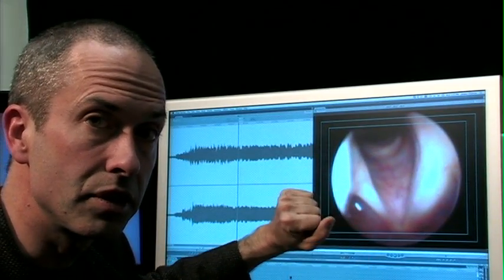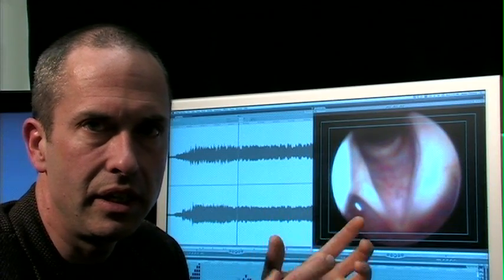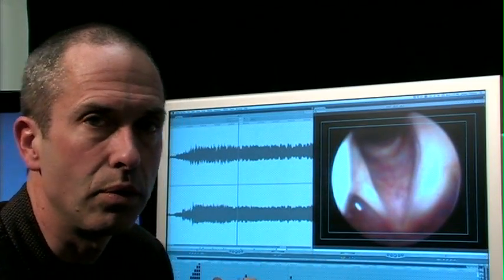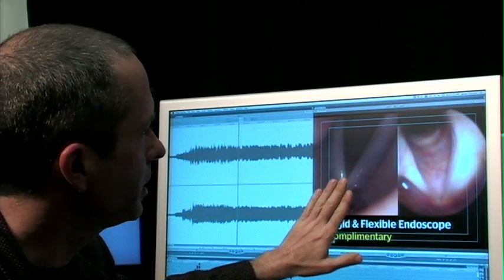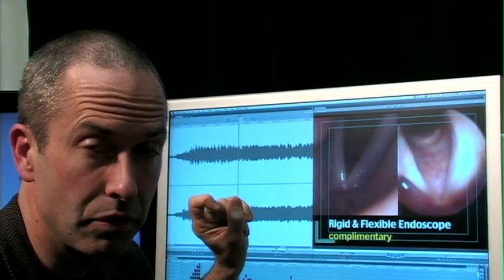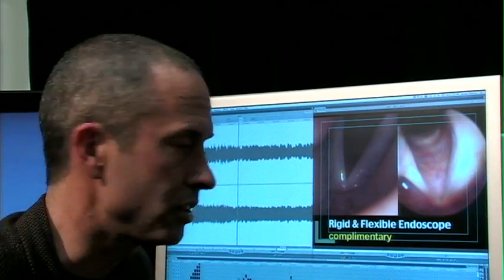The person can tighten and loosen the left side, but there's nothing left in the right side to tighten or loosen — this side just flutters when the person speaks. And as any musician will know, if you have two different strings tuned to different pitches and you blow air through them, you get two different pitches at once. Diplophonia. Now we have the reason for the hoarse voice. Getting this clear view from above and seeing the lack of motion, but adding the perspective of the utter thinness revealed by the flexible endoscope, tells a more complete story as to what's causing the hoarseness.